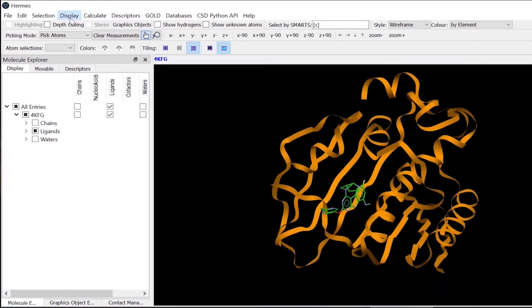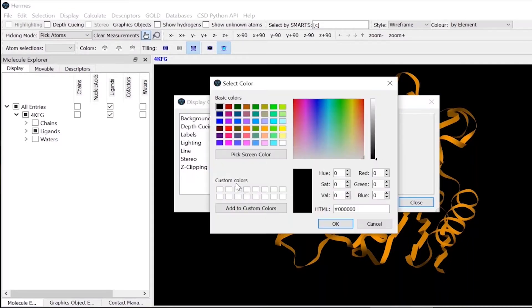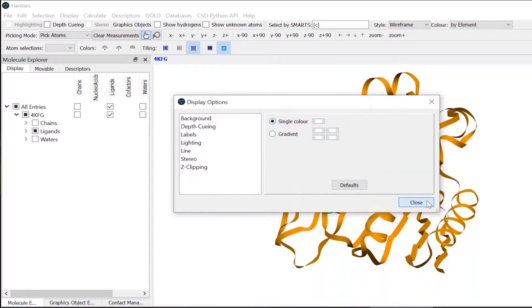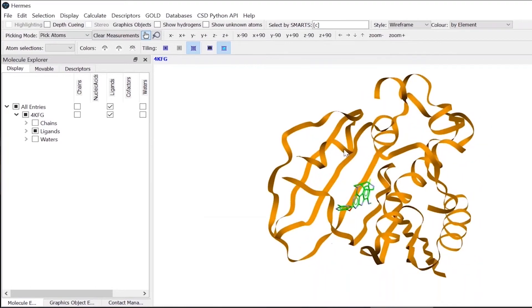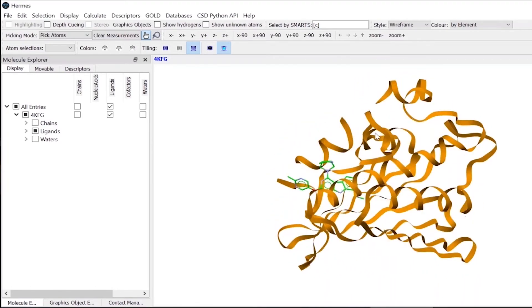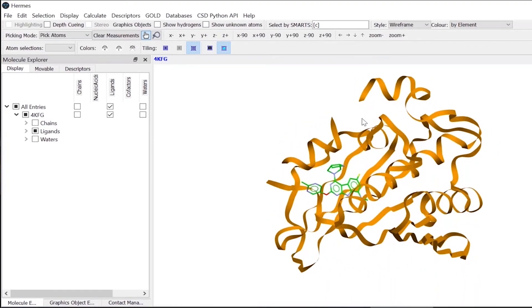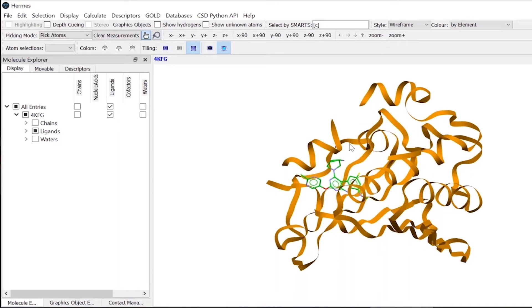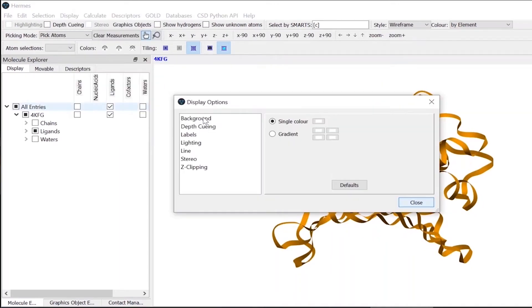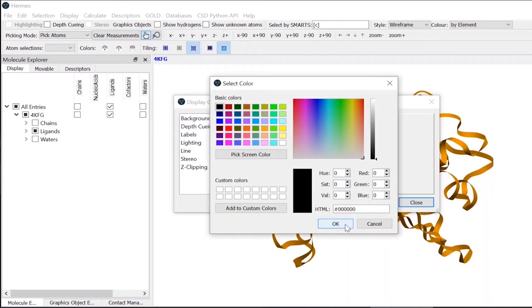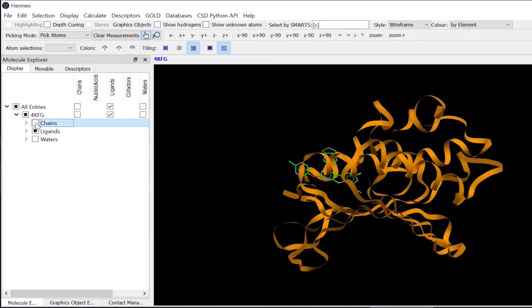Also, you can change your display coming from here, which is generally white background. We prefer this when we are saving images for publication. So this way, you can save images for publication. So I'll go back again to the original screen.